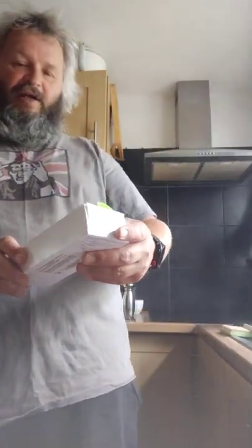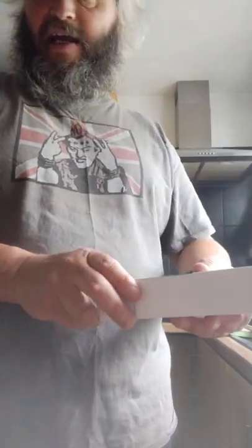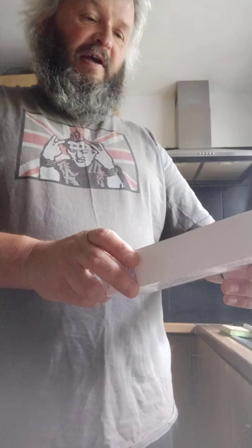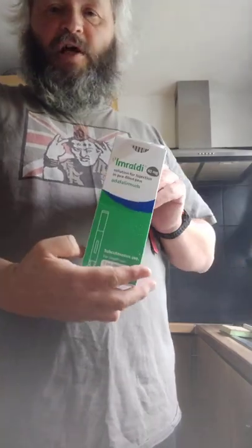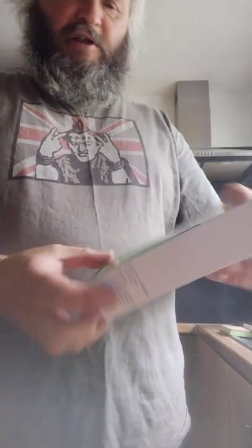This is a quick video to show you how easy it is to self-inject with adalimumab. This one is under the trade name of Imraldi, but the most common brand is Humira.